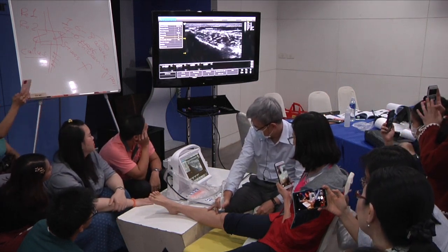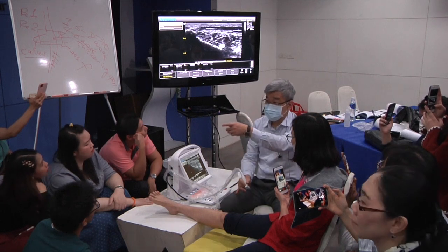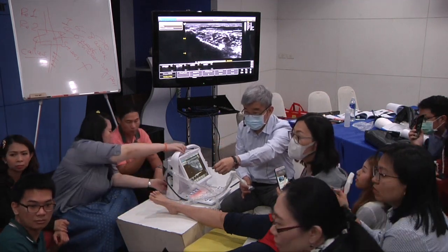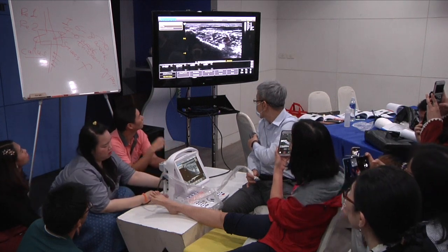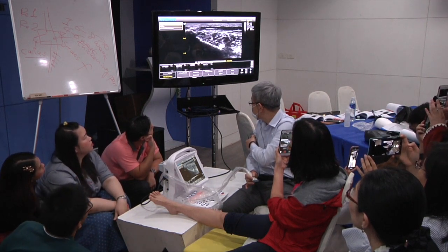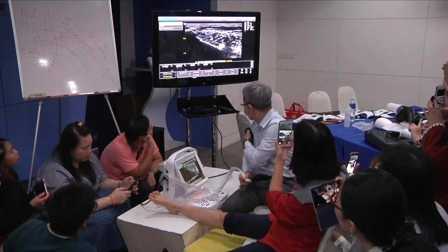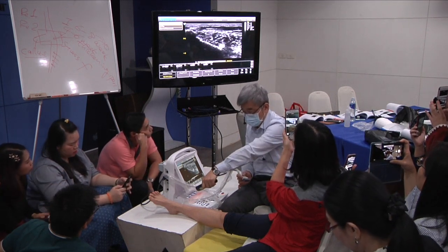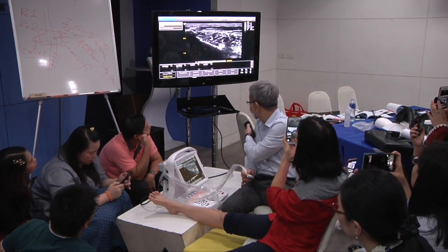I know this is proximal, or this toward the tibia. Okay, this is a muscle here, tibialis anterior. Can you give me the pointer? Tibialis anterior, a border. Small. This is the deep peroneal nerve. So the deep peroneal nerve stays with the tibia bone until it goes to the foot, the front of the ankle. So, tibialis anterior.